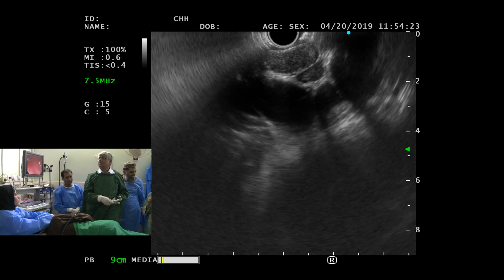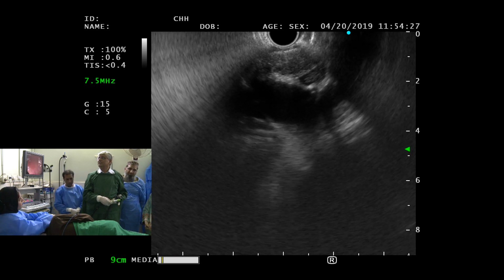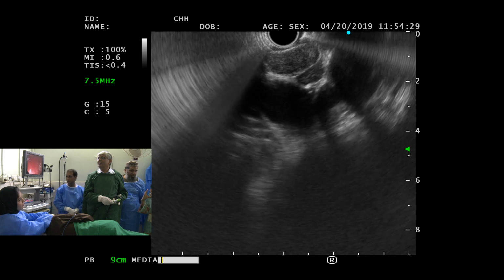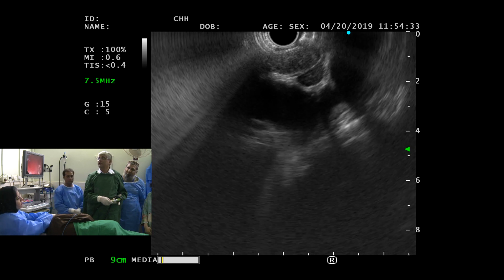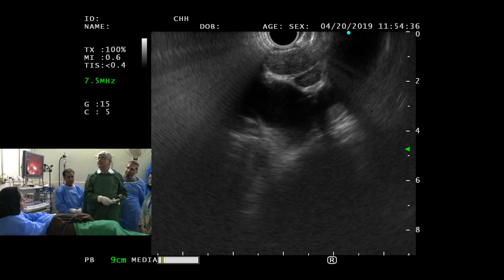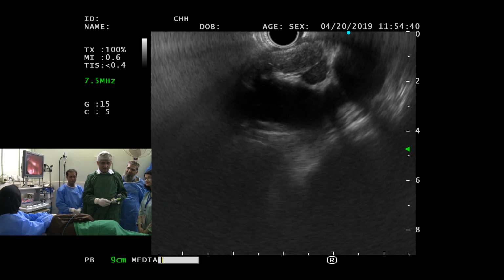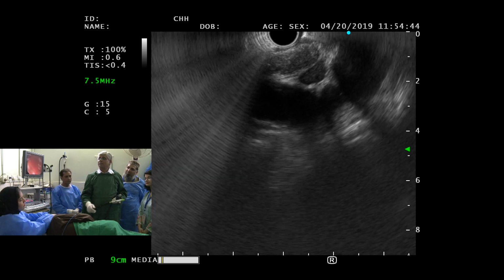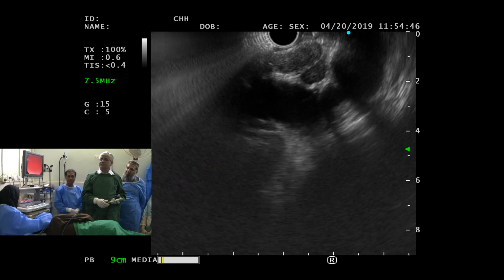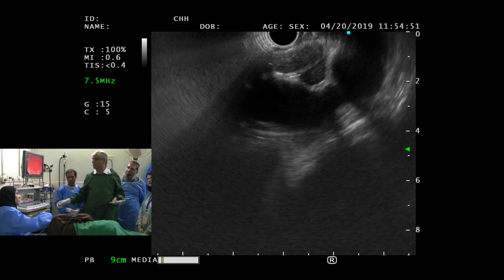Now, Khalid, you told them that you should not be playing with the sheath. In this case, the sheath actually was not where it should be. If you saw the sheath coming out here, I usually bring it out there and then I take it back. If you're not getting a good trajectory, it's fine to go for subcarina too. That is quite big, I think it's okay. If you enlarge the image a little, it will be easier for you, for 2 minutes.